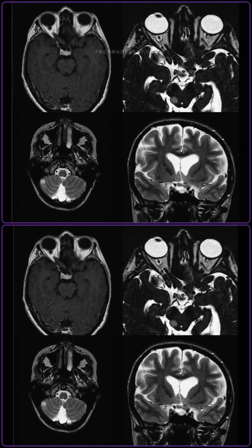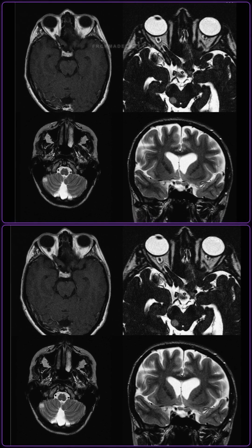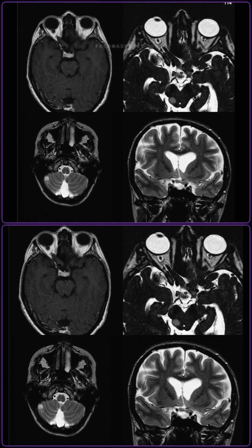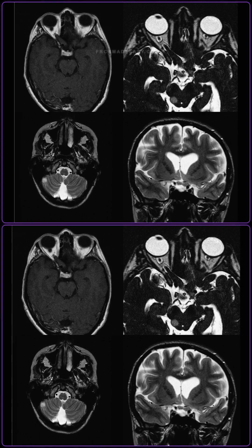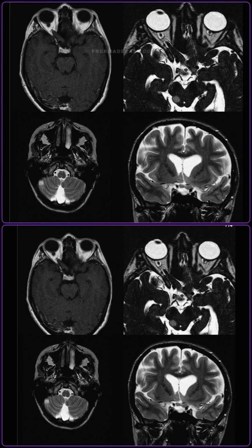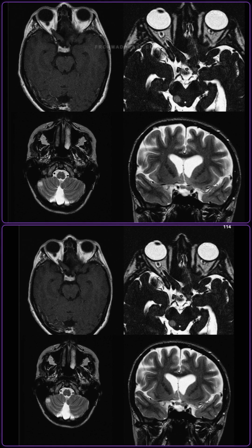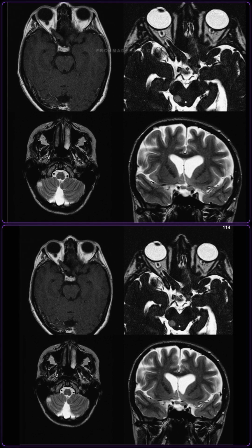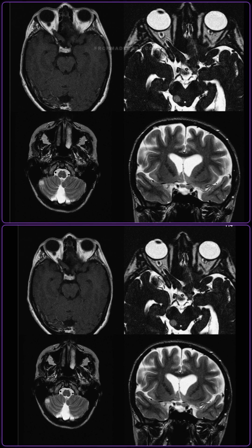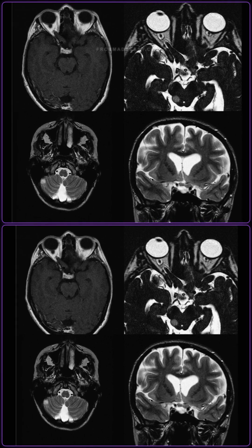Complications include progressive visual field deficits, blindness, and development of malignant astrocytomas in the cerebrum or brainstem. As a radiologist, I would recommend a baseline post-contrast brain and orbits MRI with thin-section fat-suppressed sequences to evaluate enhancement. If any hamartoma shows interval expansion, mass effect, or enhancement, I would suspect malignant conversion to an astrocytoma.